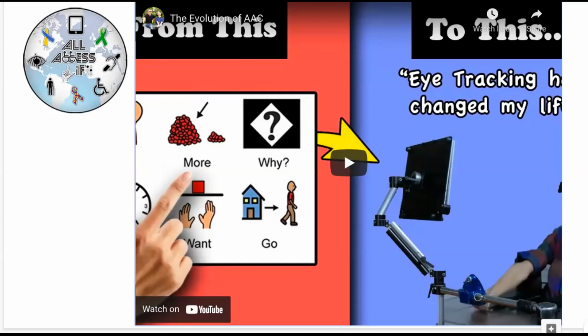So eye gaze was fastest, partner assisted scan second fastest, and two switch scanning fell into third place for Brad. But for another individual, it may be different.